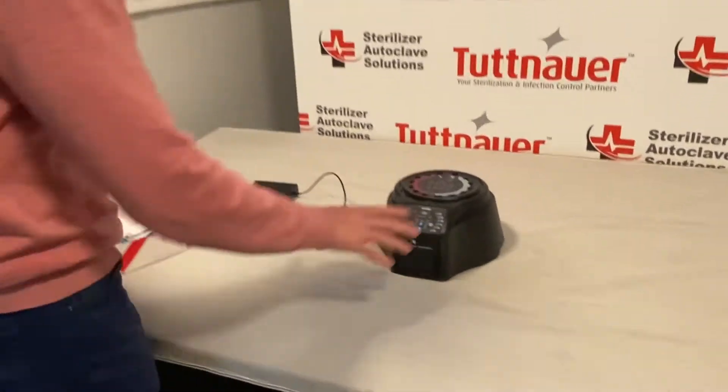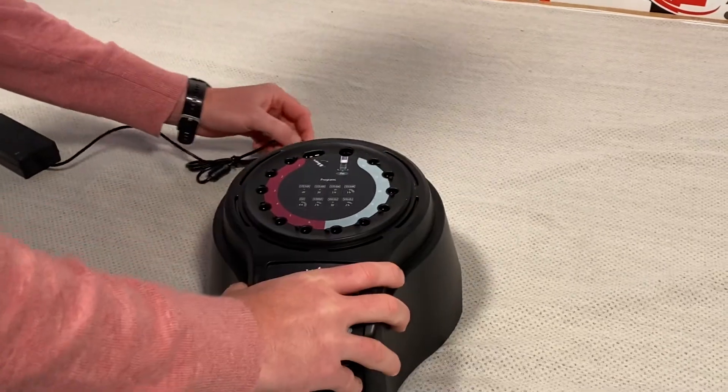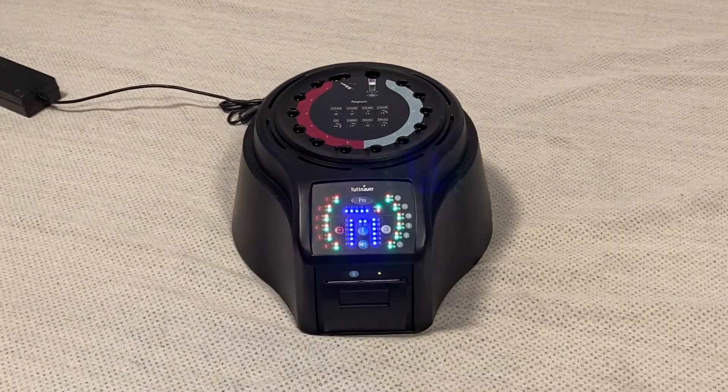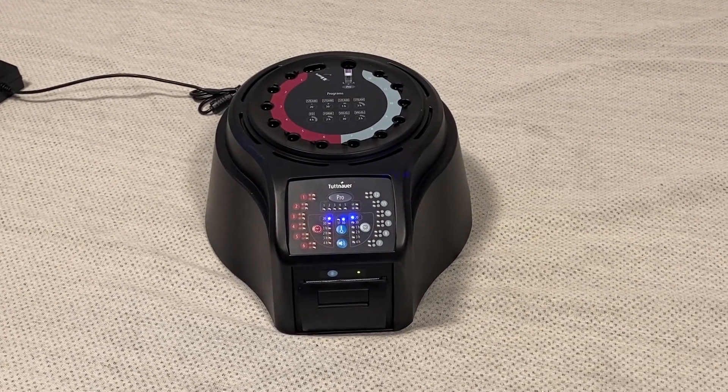As you can see, we have the reader out already. First step: plug it in — a little AC power cord right into the back of the unit. There is no power button on this machine; it's automatically going to light up and let me know that it's working.